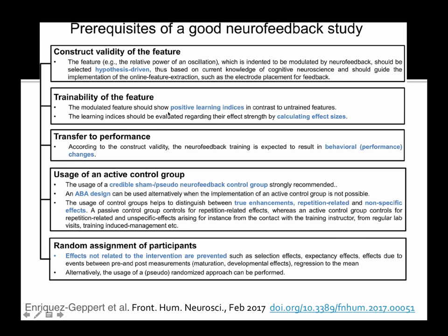What is the number of subjects that you will need? How many runs does the subject need to perform to be able to modify that? Is that doable, right? If I need to have someone for 8 hours in the scanner 5 days a week, probably won't be practical. If the person can be in the scanner an hour a day for a few days, it may be doable, at least until we train and find out how to do it outside the scanner.